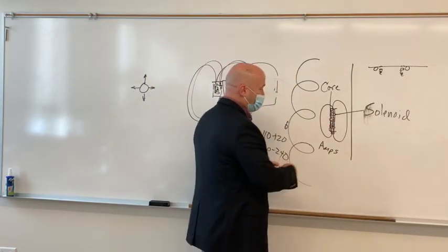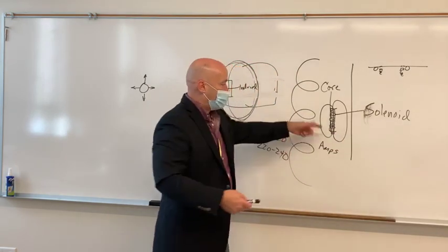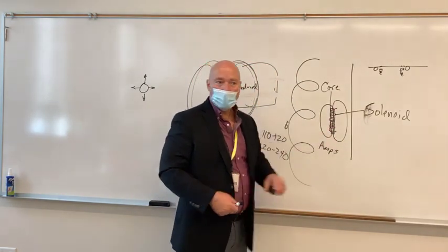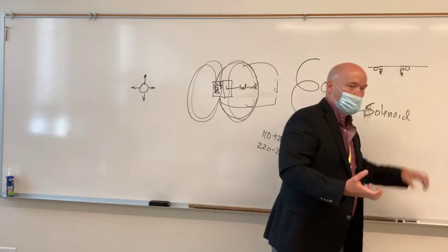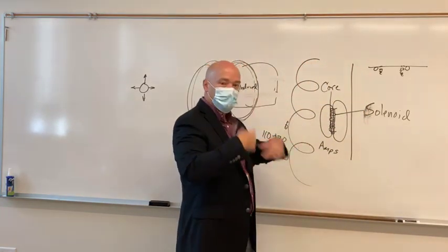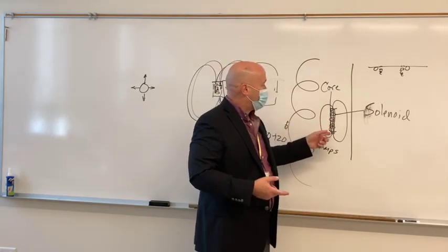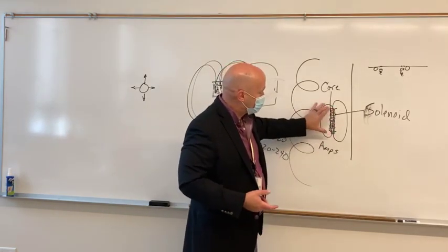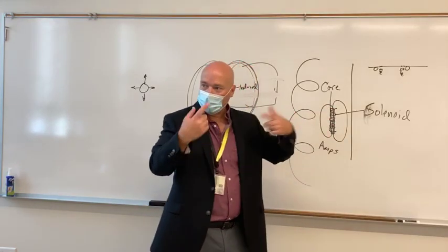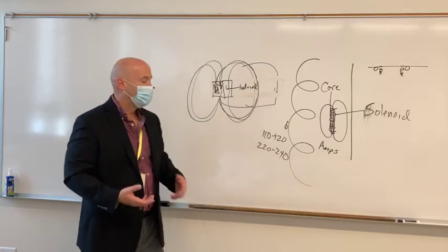And what I had before were some of these wasted magnetic fields spinning around each individual wire. Most of the magnetic field was going to join up together and make a bigger, stronger magnet, but you lost some as it spun around the wire. By putting the ferromagnetic core into the middle of it, some of those spinny little magnetic fields are going to join together, and now you've got a more efficient magnet.